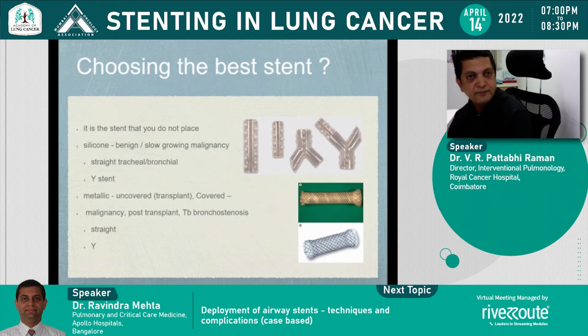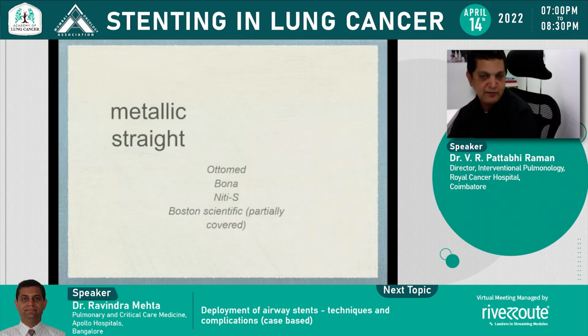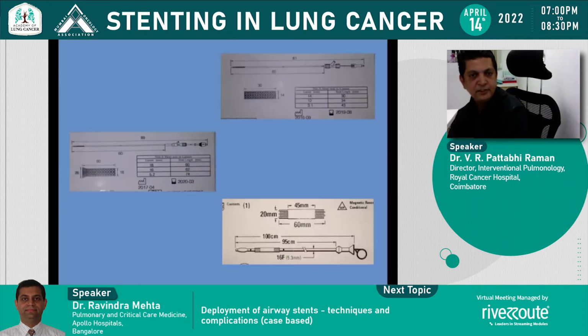Next. So metal stent, which is what I'm going to concentrate on a little bit. There are different companies in India. You have Automed, you have Bona, you have Niti, you also have Aero Stent, and you have Boston Scientific, which is partially covered.